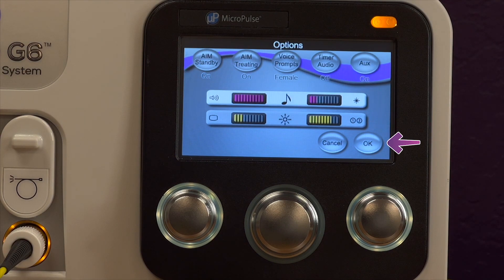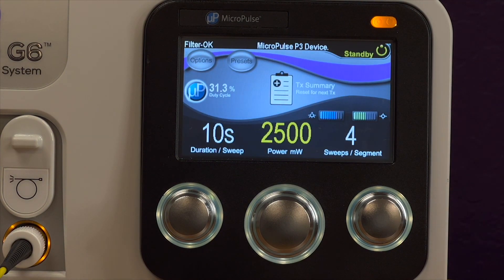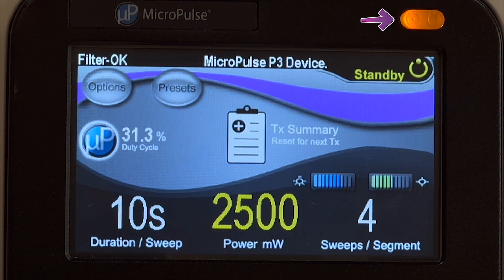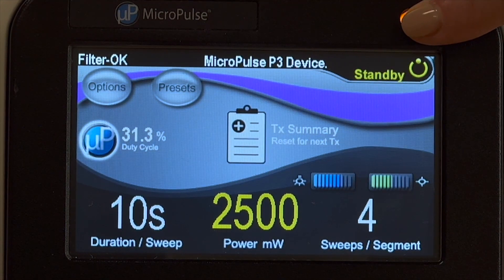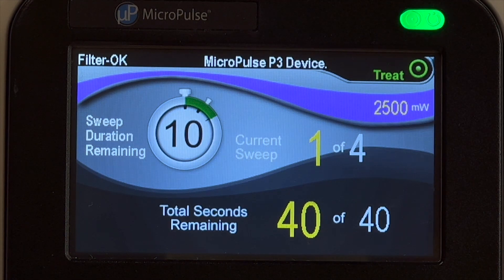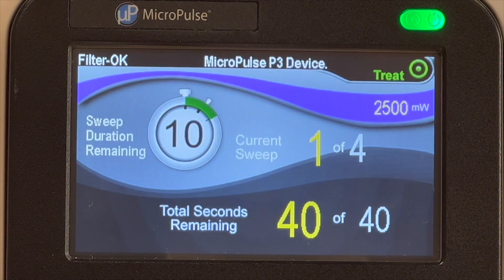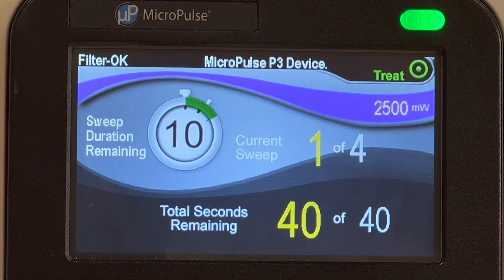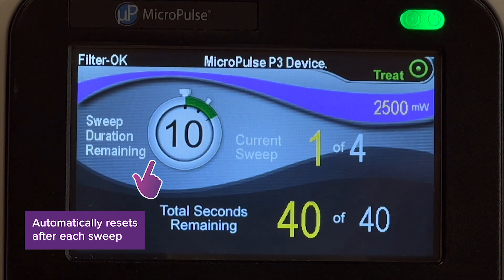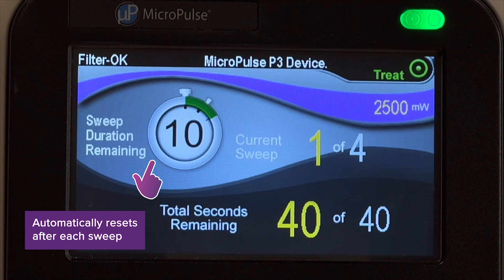Select OK to close this screen and return to the standby screen. You're now ready to treat. To enter treat mode, press on this button to enable the laser. This is the treat screen. There are no user-adjustable fields on this screen. The treat screen displays the information previously programmed in the standby screen. Here is the sweep duration remaining field, which tracks the progress of a single sweep by showing the remaining time on the stopwatch.